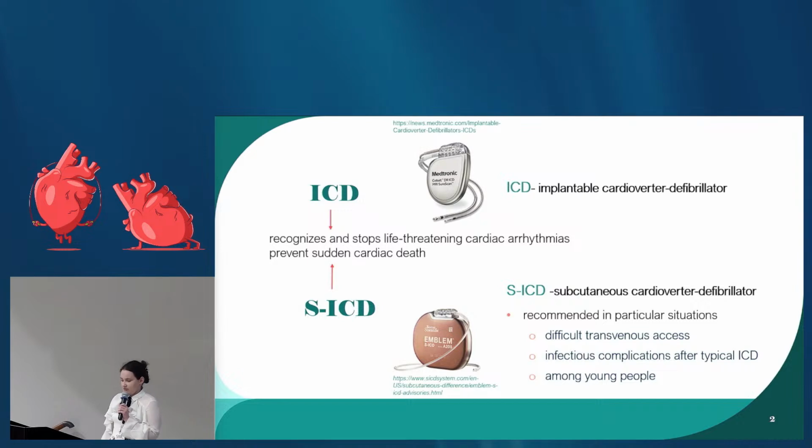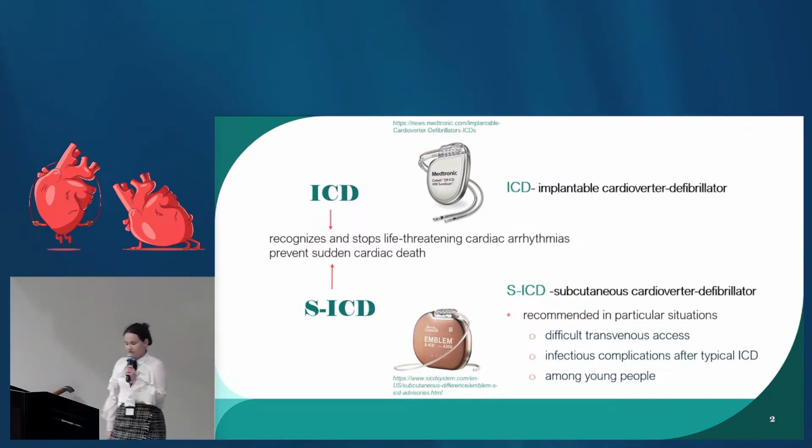ICD, SICD was developed. SICD stands for Subcutaneous Implantable Cardioverter Defibrillator, and this is how it looks. This device is implanted entirely under the skin, leaving the vessels and heart untouched. It is recommended in particular situations, for example, difficult transvenous access, infections, complications after a typical ICD, and among young people.